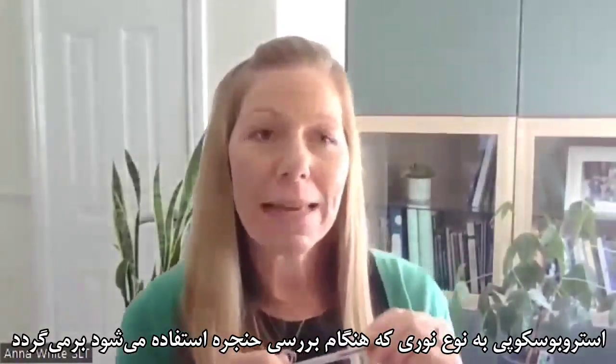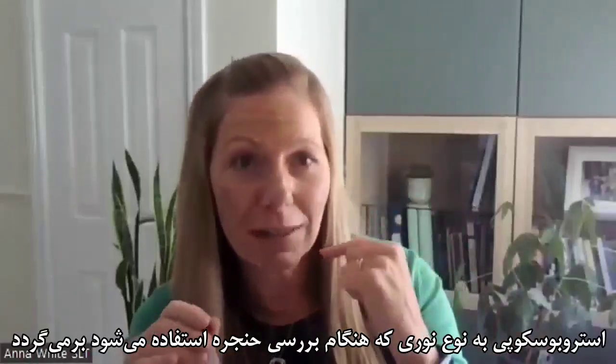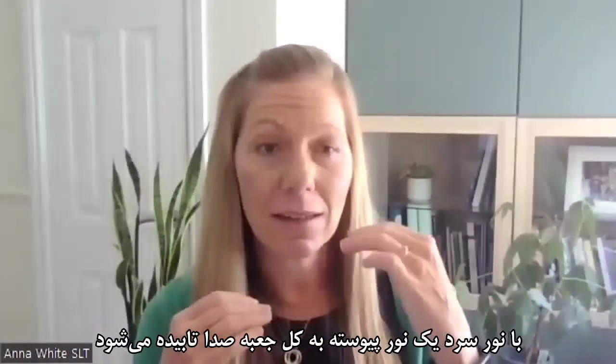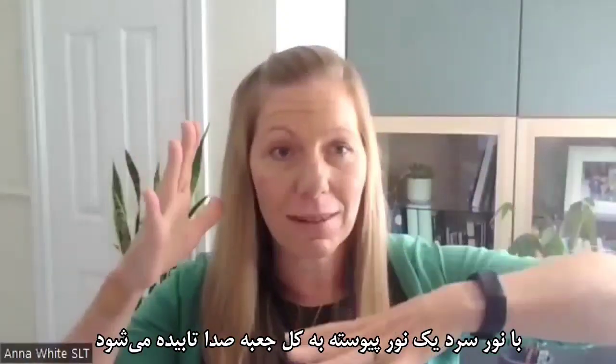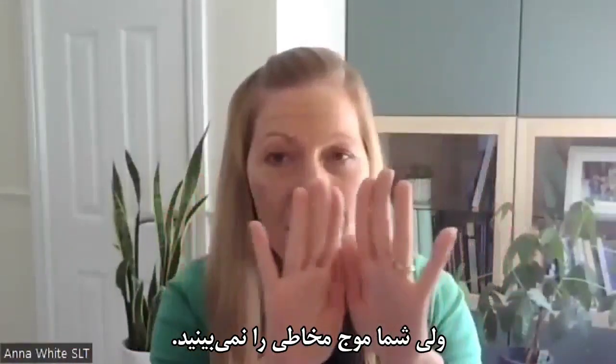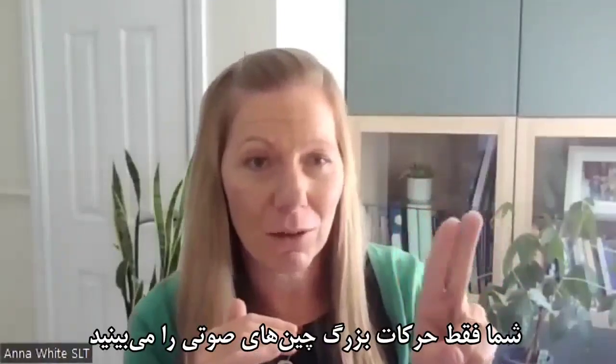Stroboscopy just refers to the type of light that's shining whilst you're examining the larynx. With a cold light, it just shines a continuous light down onto the voice box. So you can see the vocal folds come together like that, but you can't see the mucosal wave. You can see the gross movements of the vocal folds.